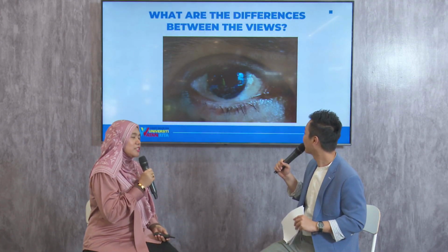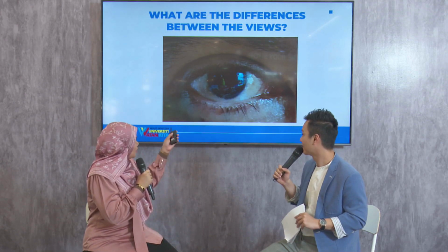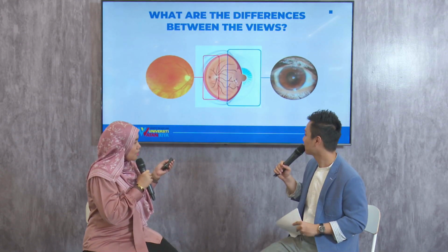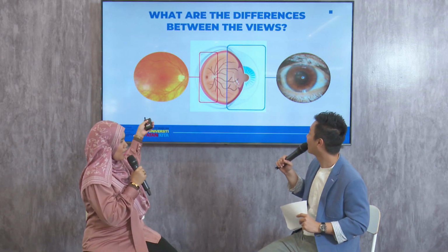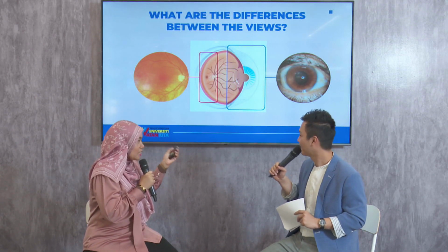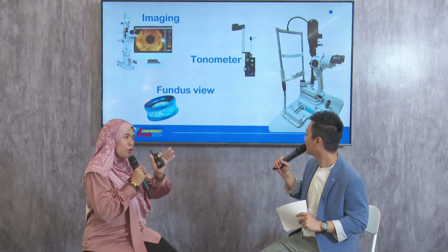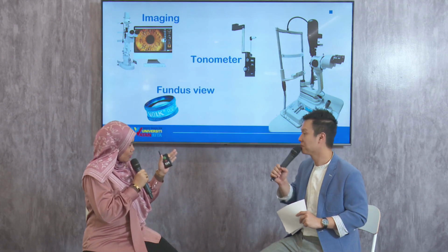Then we need to have a look at the benefits of incorporating the slit lamp, rather than just checking the eyes, the power. This is the regular eye that we can see with the naked eye. But with the slit lamp, it can be enlarged until we can see the fundus here. This is at the back of our eye. So the whole ocular structure we can view through the slit lamp, but of course with attachments or auxiliary lenses. The slit lamp as it is just looks from the cornea, the outermost part of our eyes, right until the crystalline lens, our lens.